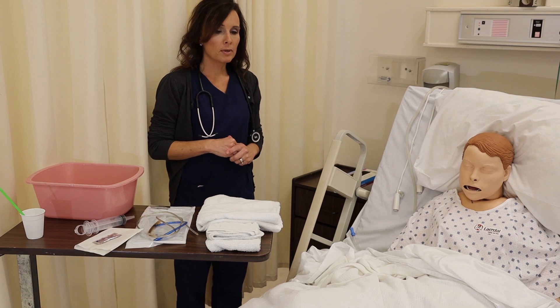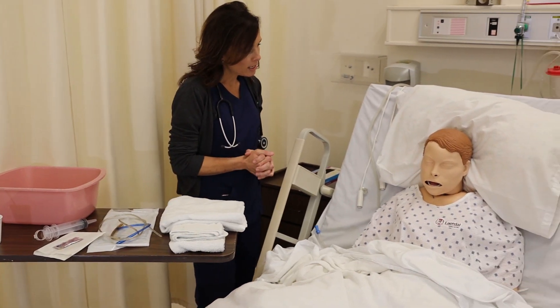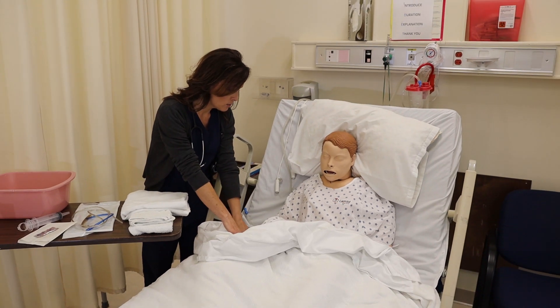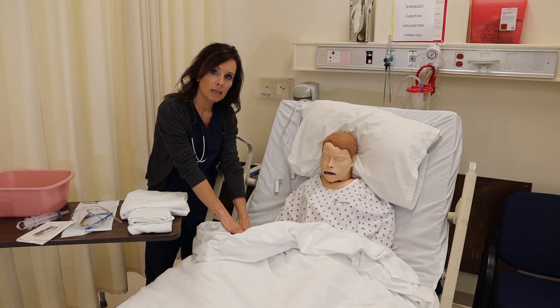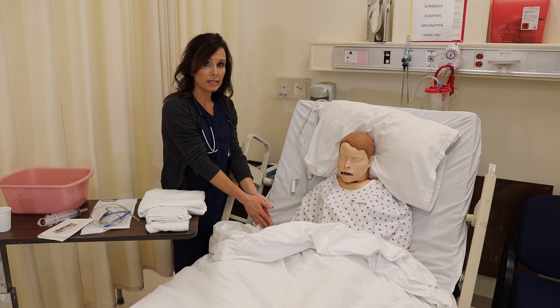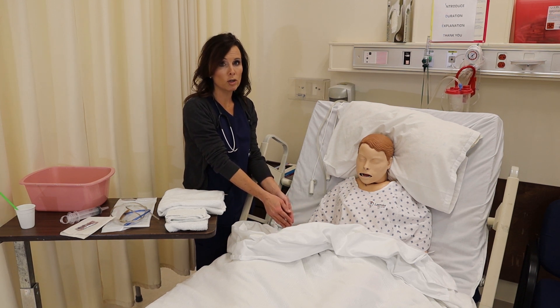I've gathered my equipment and I'm going to come to the patient's room. I'm going to wash my hands and then come in and identify my patient. Hello, my name is Heather and I'll be taking care of you today. Can I ask your name and date of birth? Yes, Mrs. Smith, that is your correct date of birth. We also want to make sure that we check for allergies to latex. People may not be aware that they are allergic to latex, but if they have an allergy to such things as kiwi, bananas, or avocados, they may very well be allergic to latex as well.